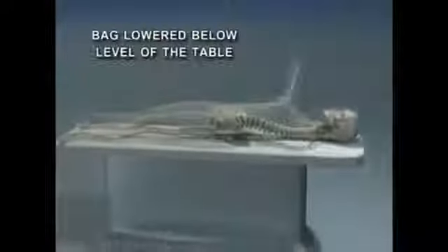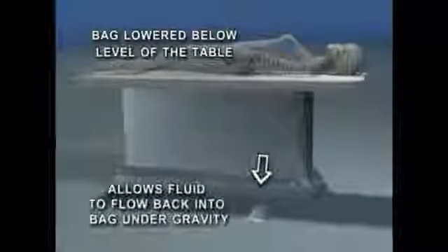A liter of normal saline is then allowed to flow into the abdomen under gravity. It should not be forced in under pressure. The entire bag is not allowed to empty, but a very small amount is left in the bag, and the bag is lowered below the level of the table to allow the fluid to flow back into the bag under gravity.